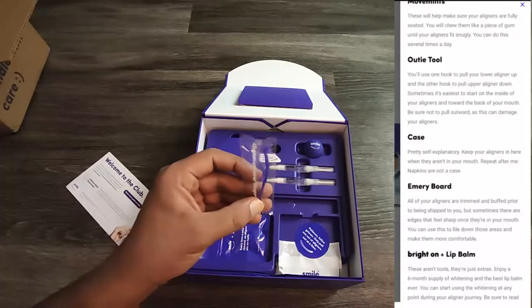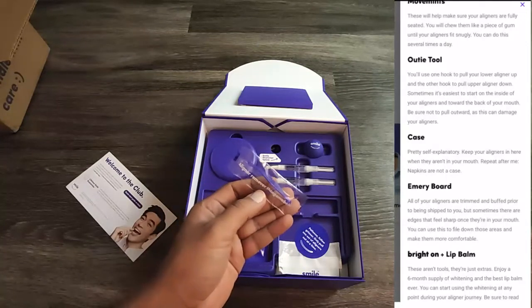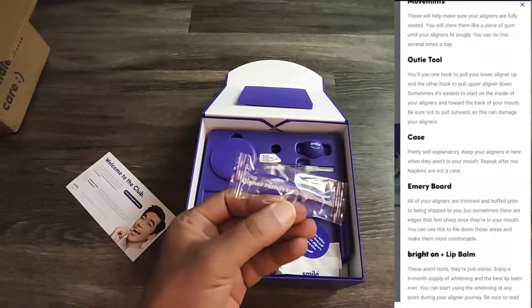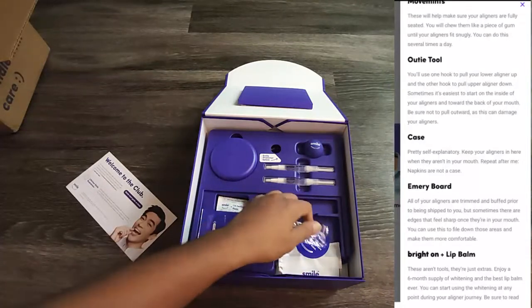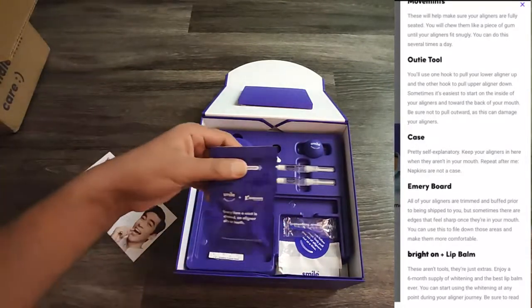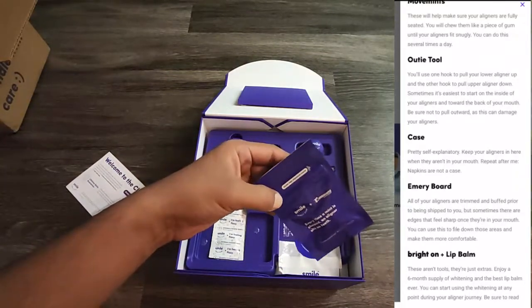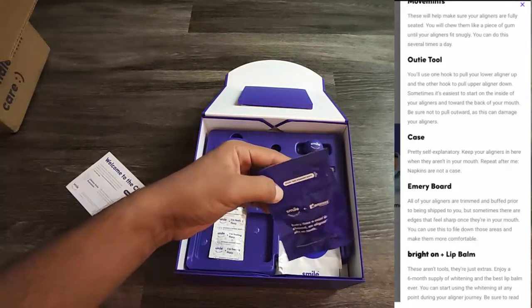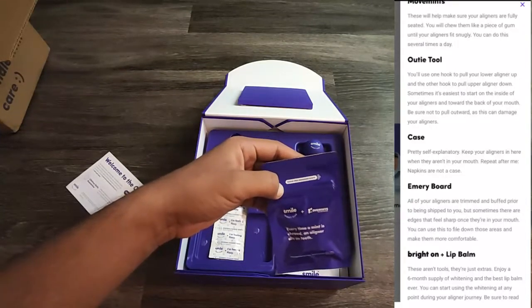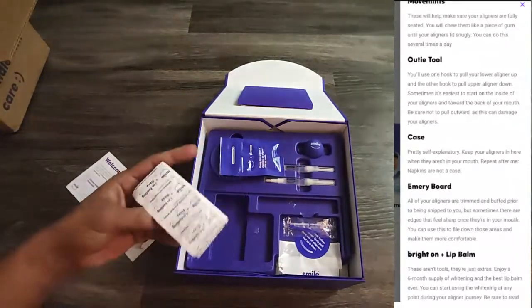This is an audi tool — you can see the description in the side image. It's used to pull out the aligners, but in my honest opinion it's a useless piece of plastic; I just use my fingers. Apart from that, there is also a movemints tool, shown in the side image, which is used to set aligners fully onto your teeth so there are no gaps.